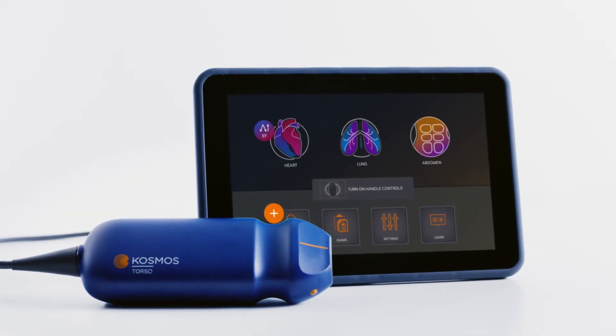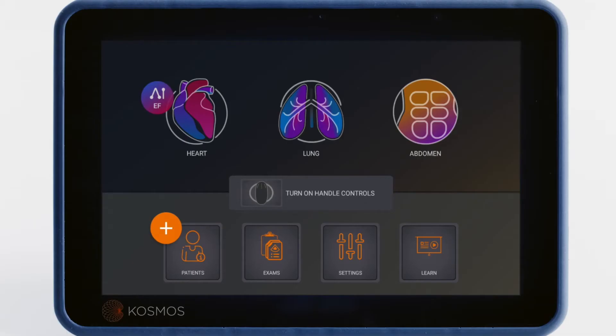Now that you've connected your probe, it's time to start scanning. This is the Cosmos home screen. The icons along the top of the screen represent three scanning presets for the heart, lungs, and abdomen.